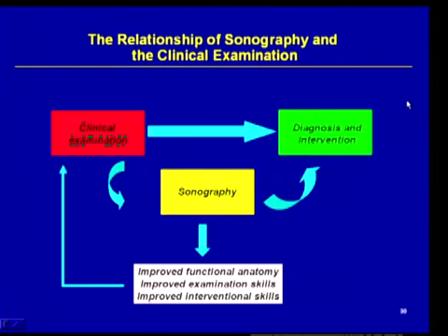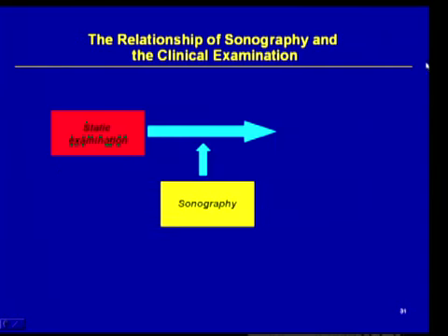So how do we use ultrasound in the clinical arena? One of the nice things about ultrasound, it enhances your clinical evaluation. We all as clinicians have very good clinical skills, and we can be very good at making a diagnosis and doing intervention in our patients. Well, the sonography comes in between that, because it allows us to improve our functional anatomy, improve our examination skills, and improve our interventional skills, specifically when doing needle guidance.